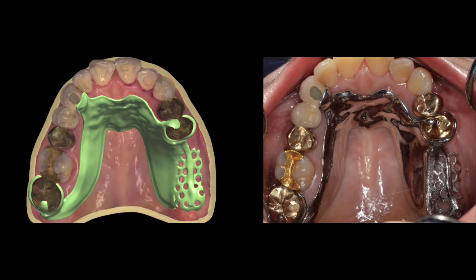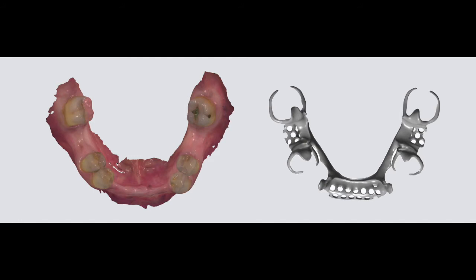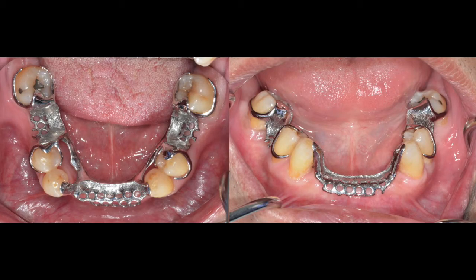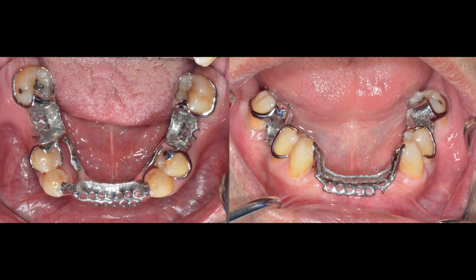Each case will be different depending on where the teeth are missing, which teeth are remaining, and the condition of the anterior and posterior abutment teeth. After fabricating the metal framework and checking the fit intraorally, on top of this metal framework we set artificial teeth and finish the final processing to deliver the final removable partial denture, called the RPD.